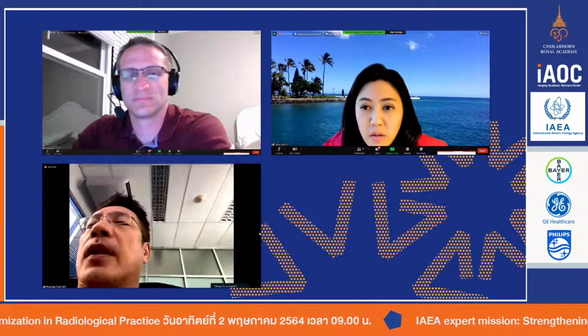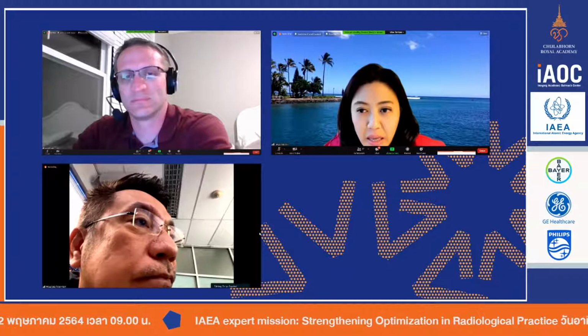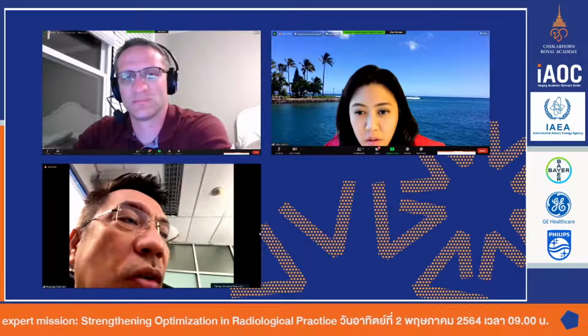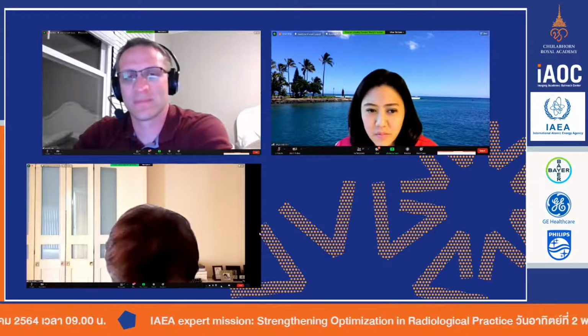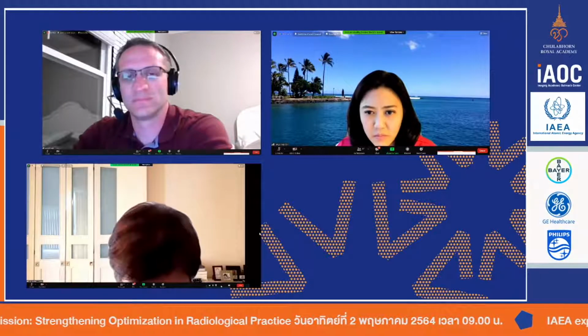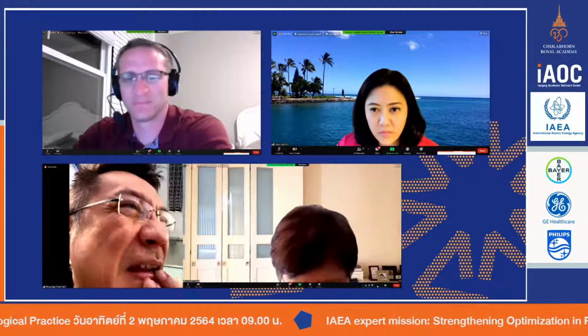So what technique do you use at the field hospital? Do your technologists increase the kV and adjust the mA level as well, or do you know? No, I don't, because we are radiologists. Sometimes we don't know. But I observe that this is the problem. So maybe we need to explore, or I would like to hear your comment on what points we need to focus on, evaluate, or explore. Maybe they don't use a grid, or maybe it is the kV they use.